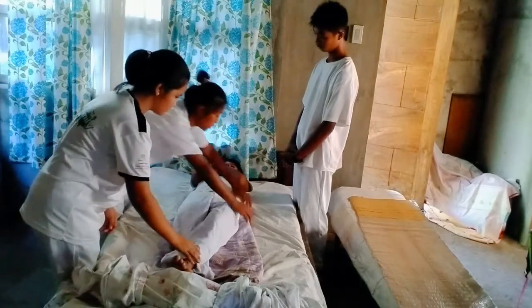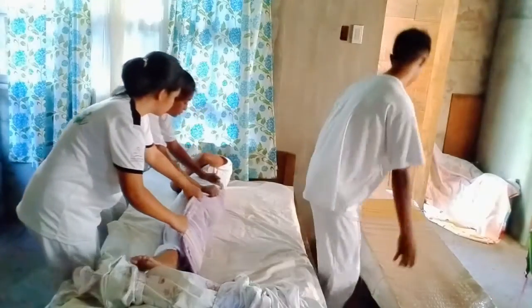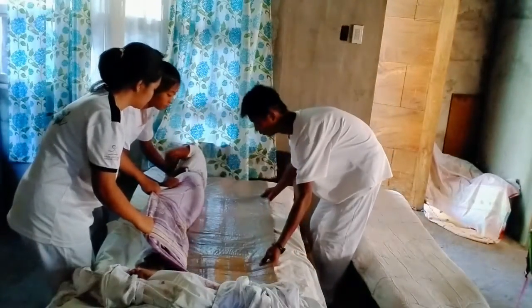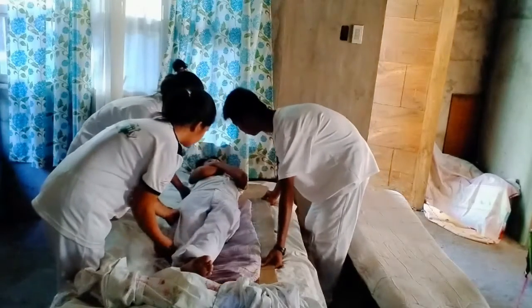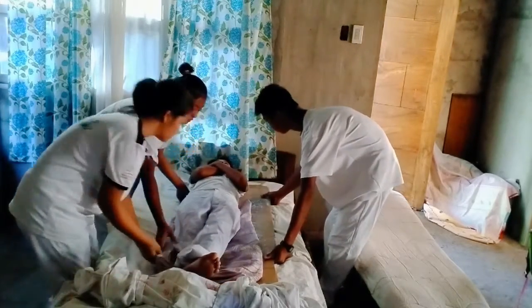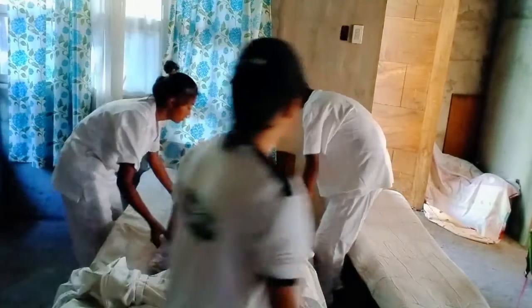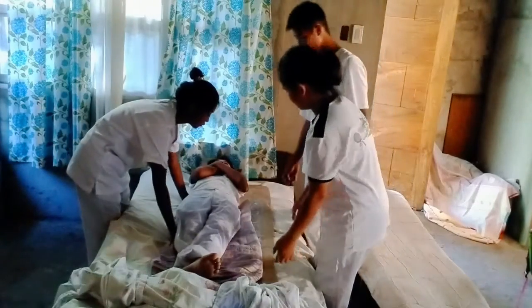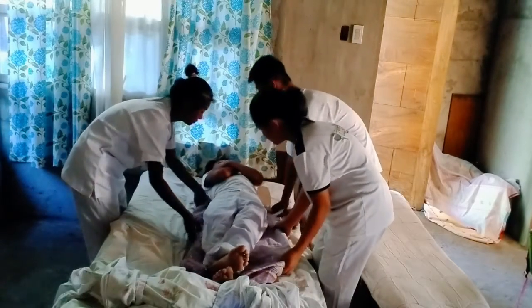On the count of three, turn the patient onto her side toward the two assistants, moving her as a unit in a smooth, continuous motion. Then slip the slide board under the waterproof pad. Gently roll the patient back onto the slide board and adjust her position to center her waist on the board.